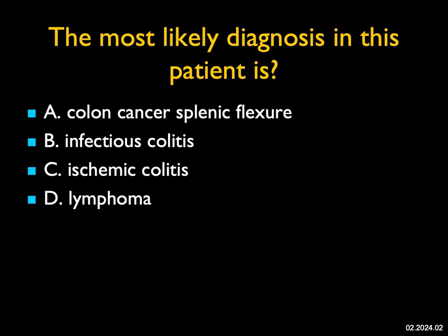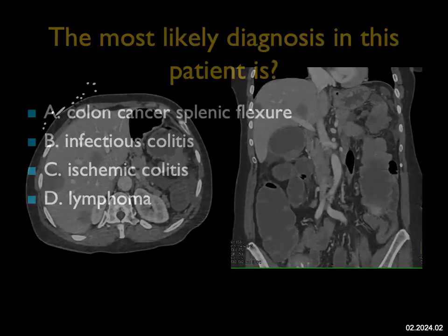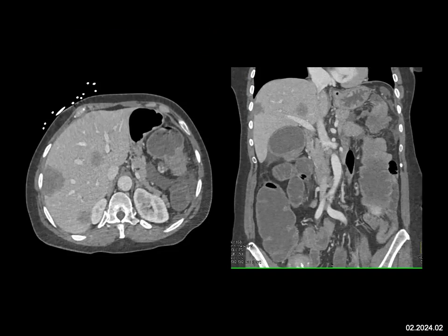The most likely diagnosis in this patient — I first see multiple liver metastases. The pattern of mets can be seen with GI primaries, but multiple other processes as well. Then I look at the patient's colon, and in the region of the splenic flexure, seen both on the axial images as well as on the coronal view, is an infiltrating tumor. It's solid. This is most consistent with colon cancer — adenocarcinoma of the colon — with liver metastasis.